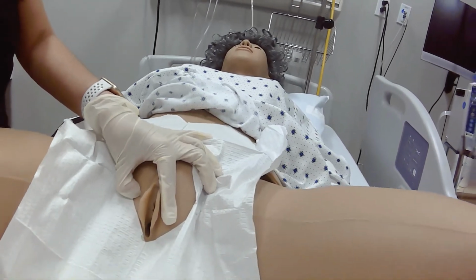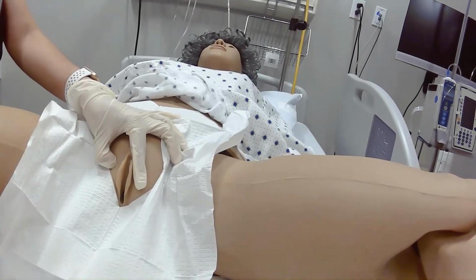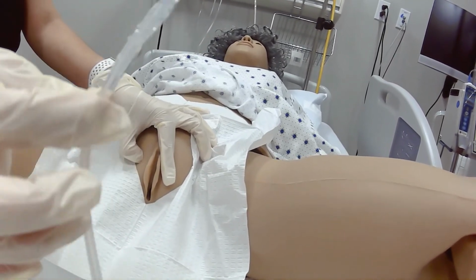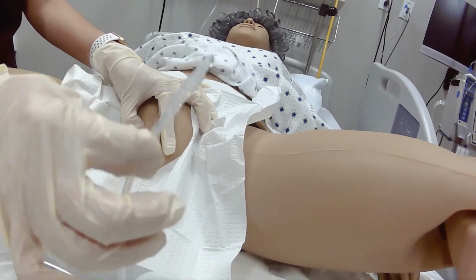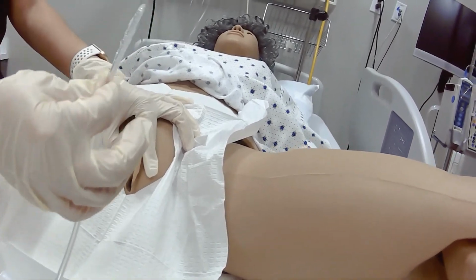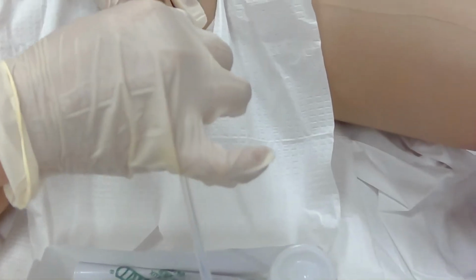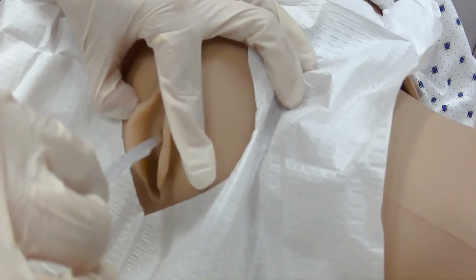Okay, so now that that's clean, I'm going to get ready. So Miss Adams, you're going to feel some pressure, okay, as I insert this catheter. So you're going to get ready to insert the catheter. So you want to hold it pretty close to the tip so you have a good angle as well as good control. Okay, don't hold it from way back here because it's just going to flop all over. Make sure that you don't let go of the labia because if you do, you'll have to start over with cleaning. Okay, so we're going to get as close as we can to that urethra.